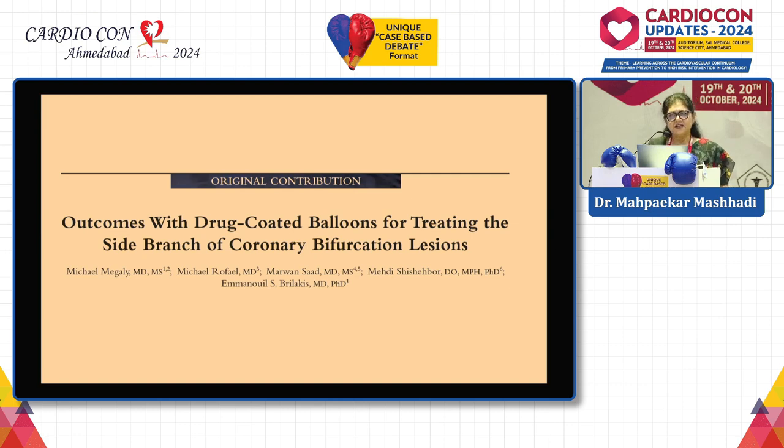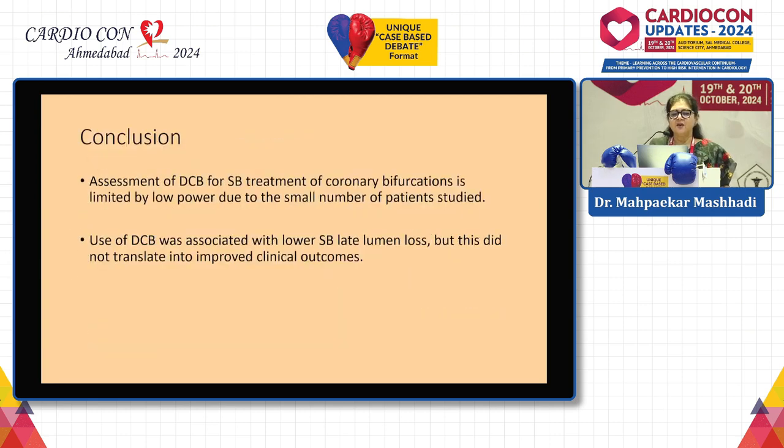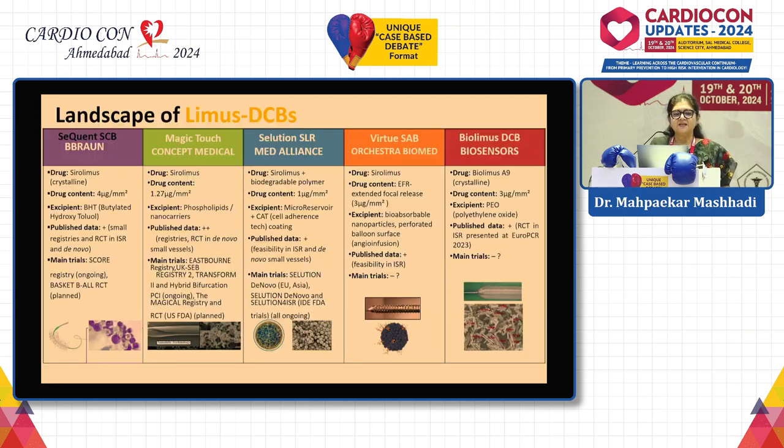Again, most of the studies that I'm going to quote here have been previously presented by my colleagues. So here what I'm going to say is, this is the landscape of the limus coated DCBs, and this is where we stand. And for this particular patient, if the lesion preparation is good and there is a good imaging facility, I would definitely go for a drug-coated balloon. Thank you.